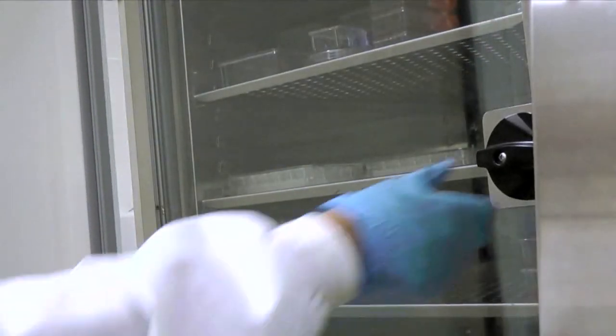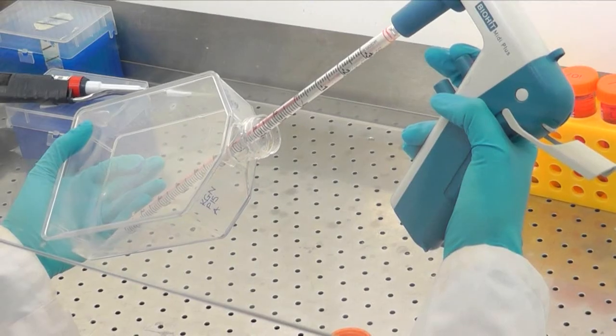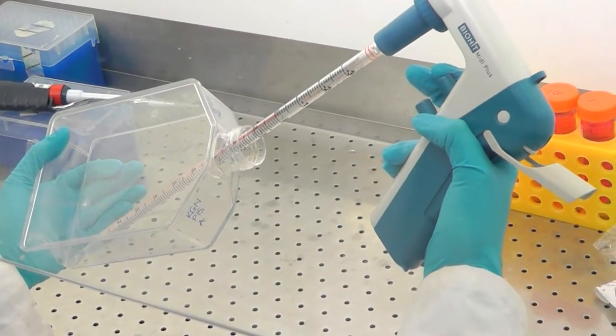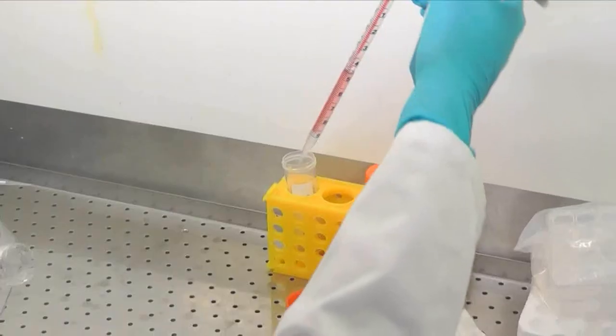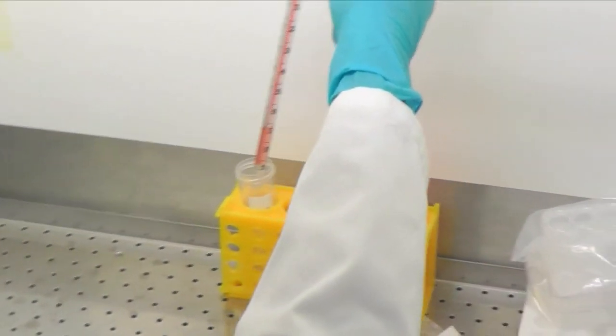Certain cell types can be more difficult to dissociate than others, and may need longer incubation at 37 degrees Celsius. If using trypsin, it is important that cells are incubated in this solution for as short a time as necessary, as prolonged exposure to trypsin can damage the cells. To collect all of the cells in solution, tilt the flask to ensure that the cells collect in one corner. Once the adherent cells are in solution, they can be pipetted out of the flask into a sterile tube.